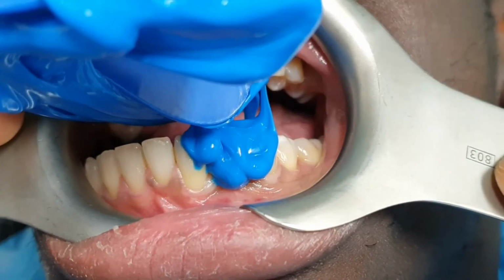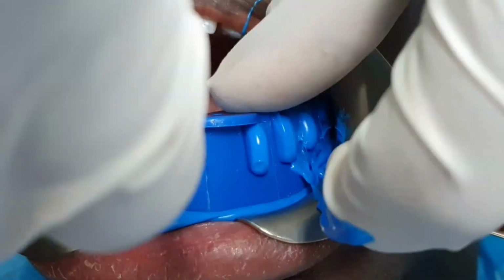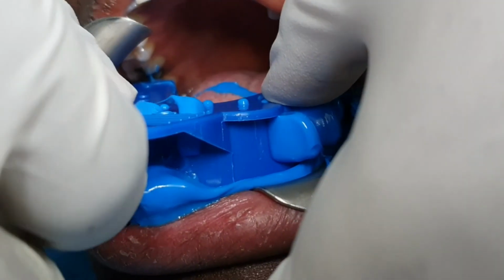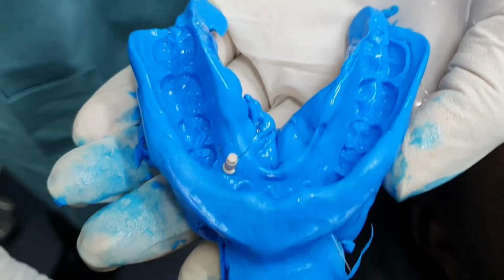You can also use materials such as Improgum, although they don't come in a handgun. But you can put them into a syringe, and then you can again position the nozzle of the syringe on top of the quick transfer and inject material through. And if you're going to use Improgum, make sure to use the hard set Improgum.